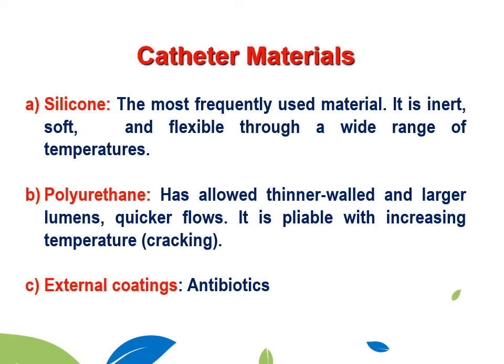Some centers also adopt the idea of coating the external side of the catheter with antibiotics, on the virtue that it may decrease the incidence of infection. However, there are no clear clues or RCTs that support that assumption.